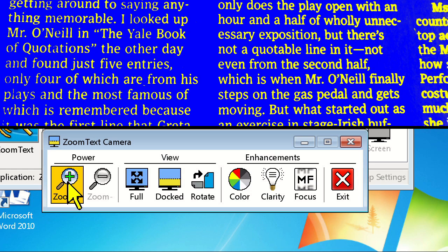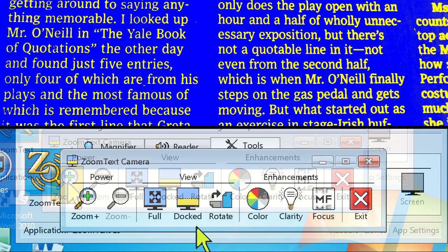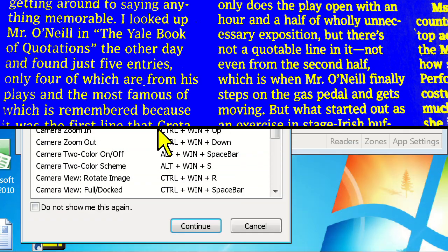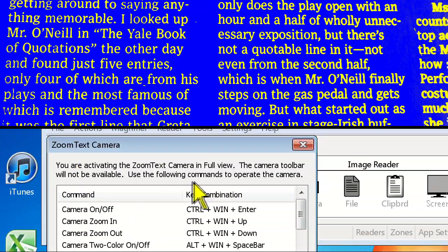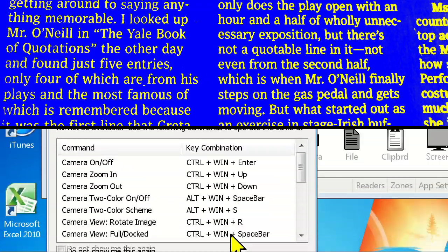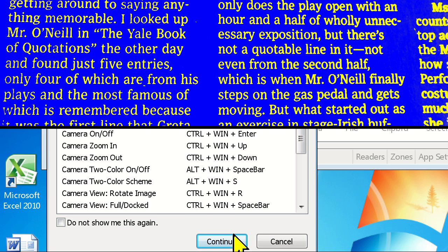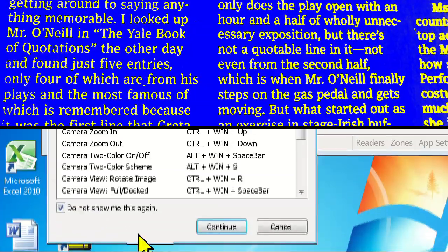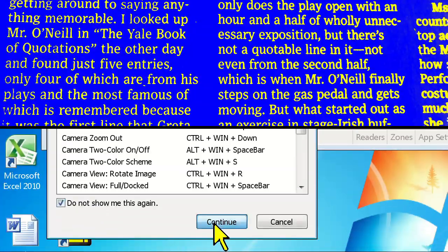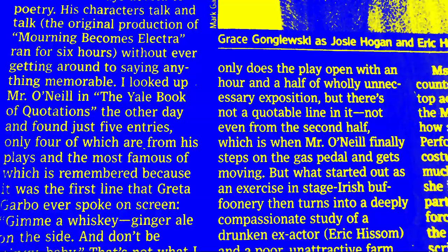Now let's go ahead and take a look at Fullscreen mode. Before we enter Fullscreen, a dialog box pops up on screen to let us know that we're entering full view, and since the camera toolbar will not be visible, it lists all of the camera hotkeys. If you don't want this message to show up in the future, check the Do Not Show Me This Again checkbox and click Continue.